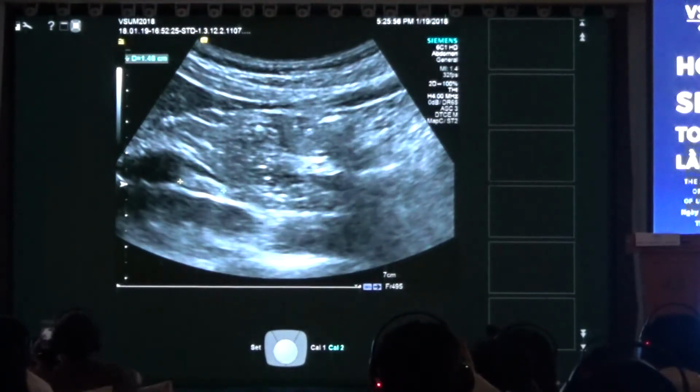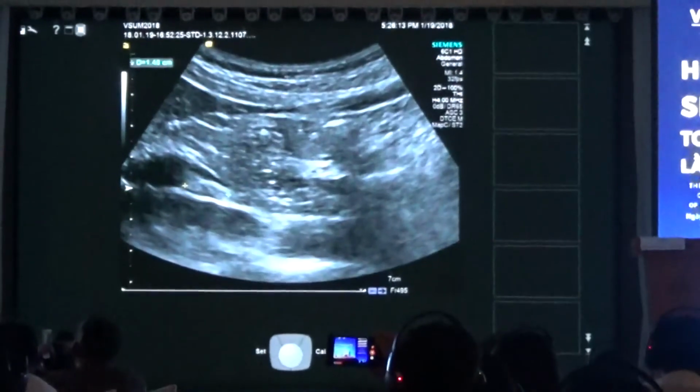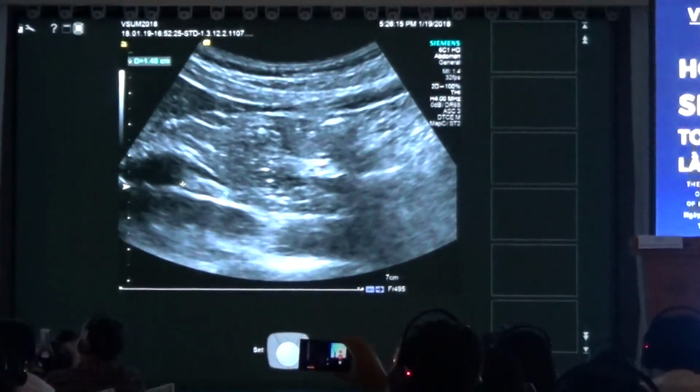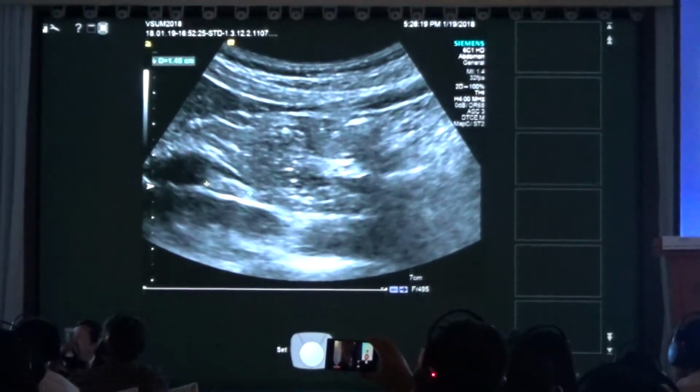So coming to a conclusion would be, first of all, before a patient comes for shear wave elastography, ask for his current complaints, go for past medical history, look into laboratory data if there is any inflammatory activity, the transaminases or cholestasis.